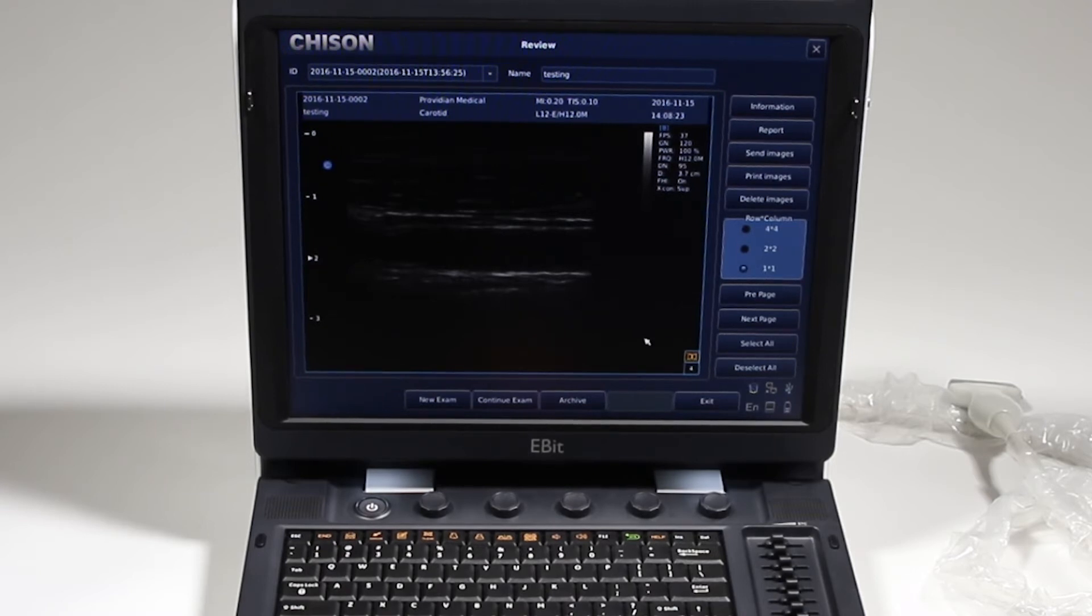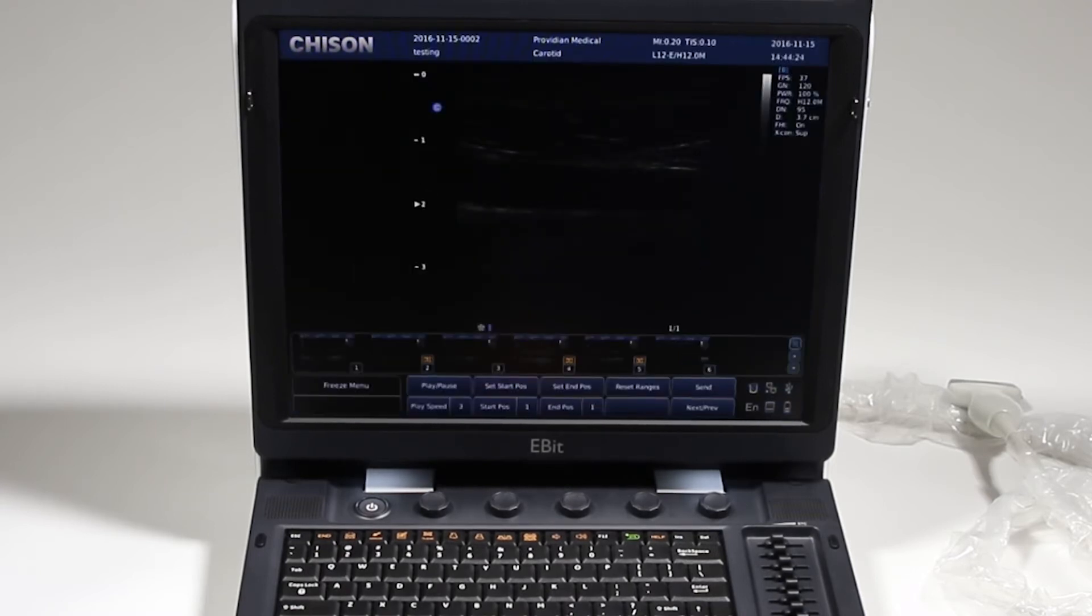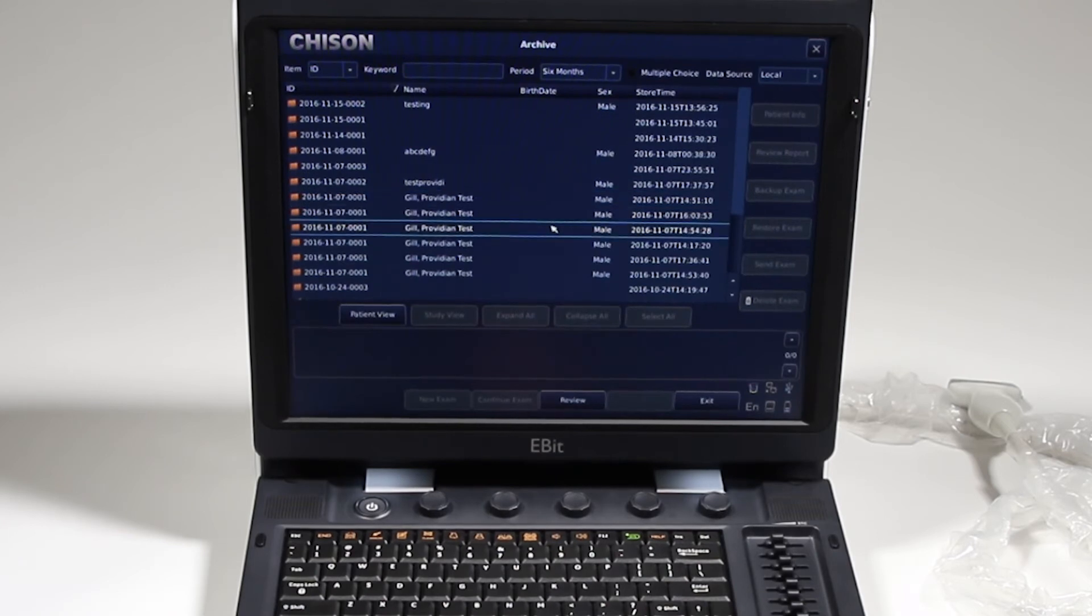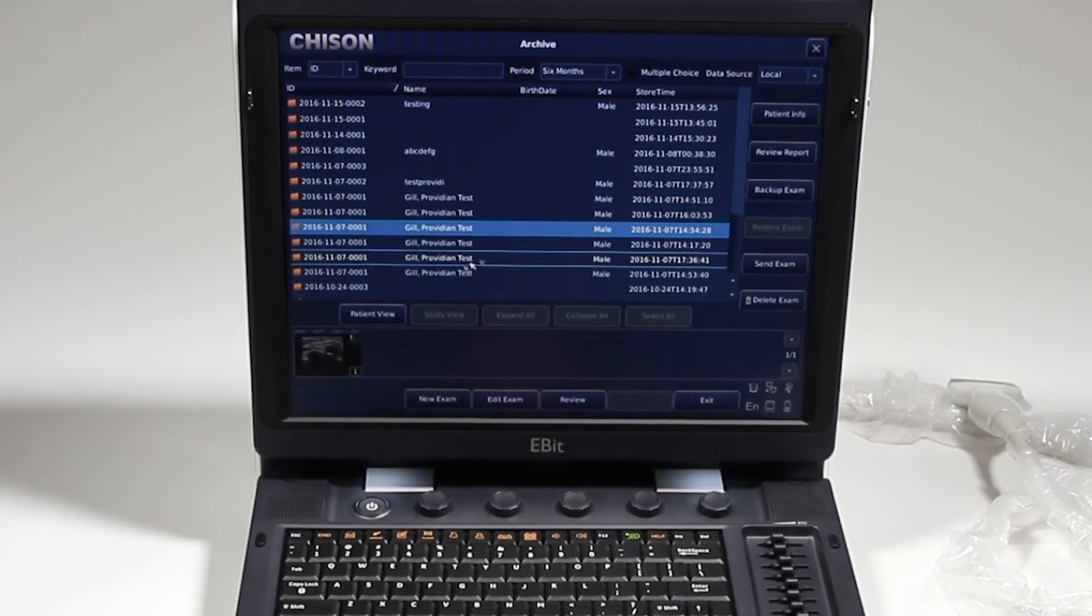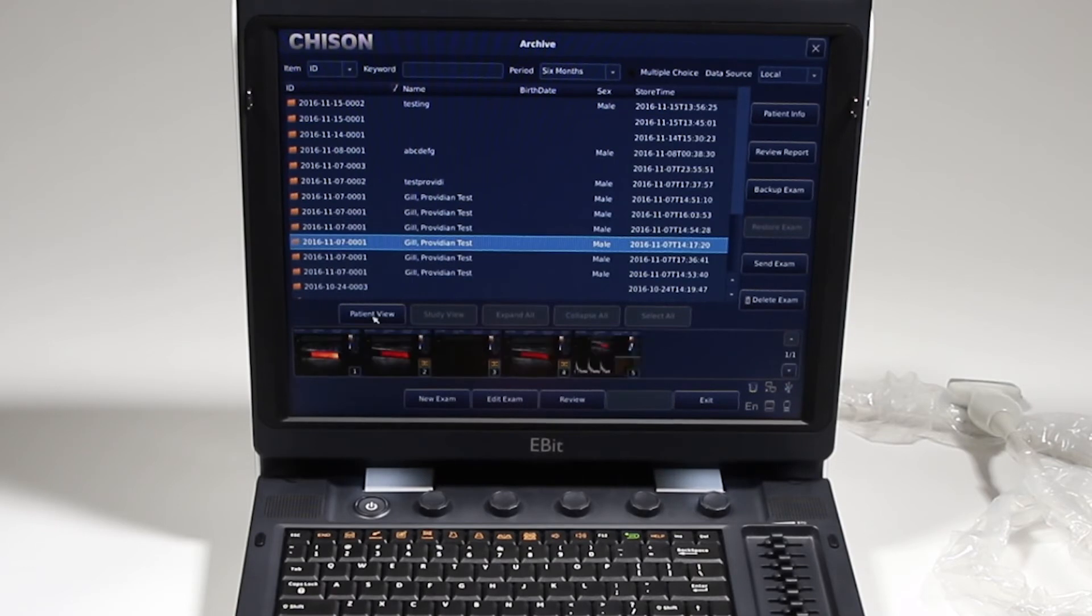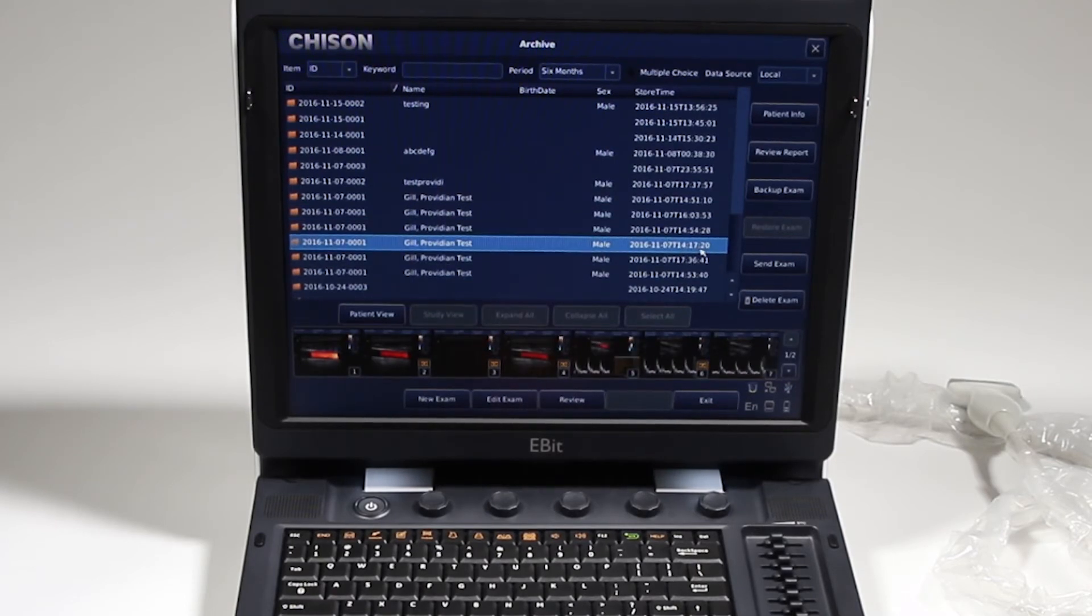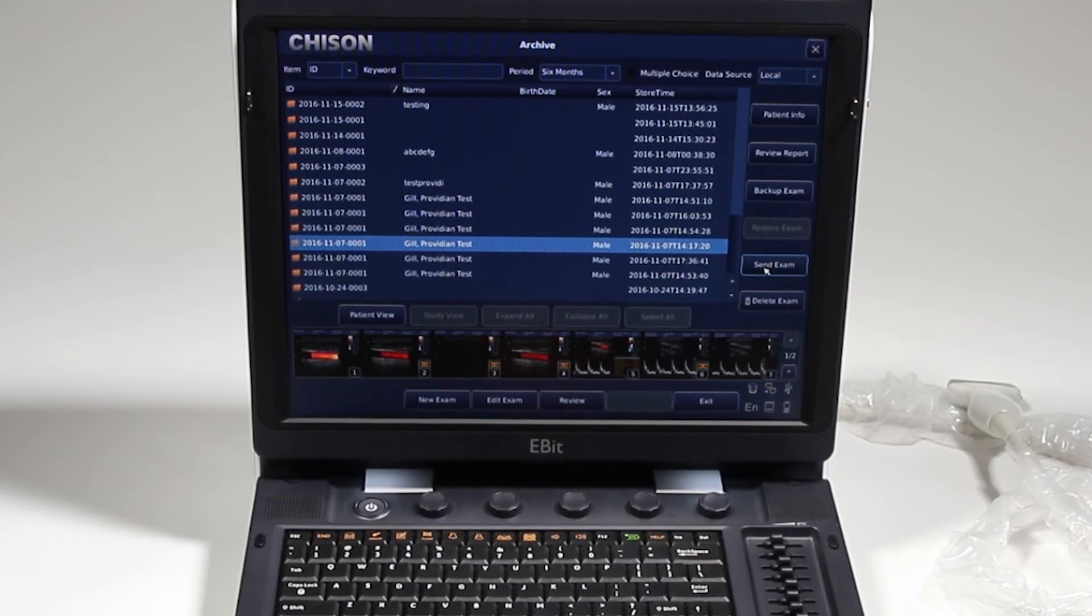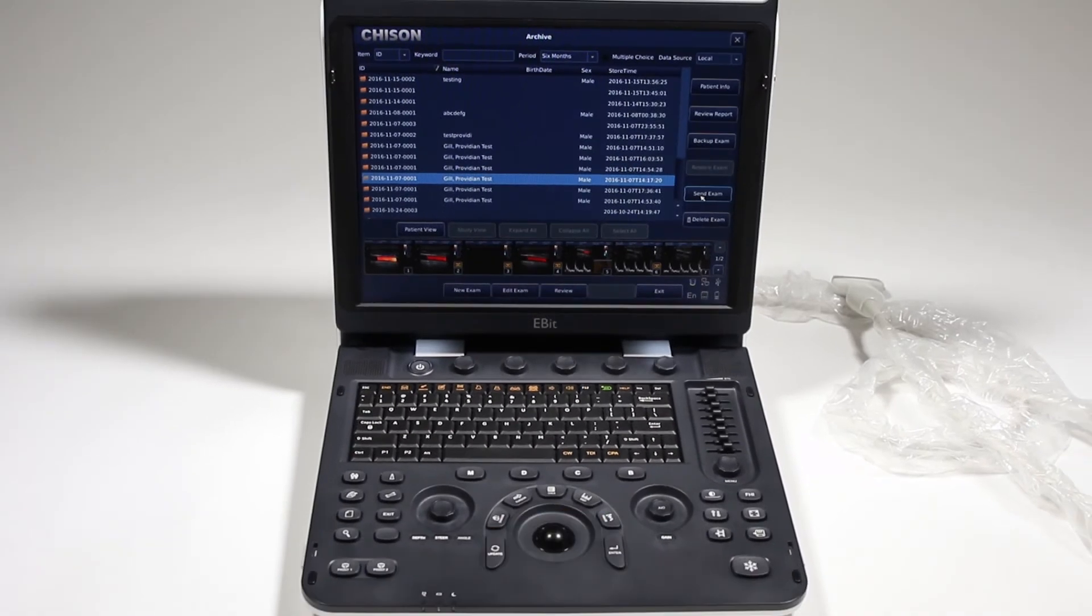Now, if I want to see a previous patient, I can click to archive and see previous exams that I've done. I get the thumbnails here to see if that's the one that I want to review. I can send this entire exam to DICOM or a USB and I'll get to that in just a moment.